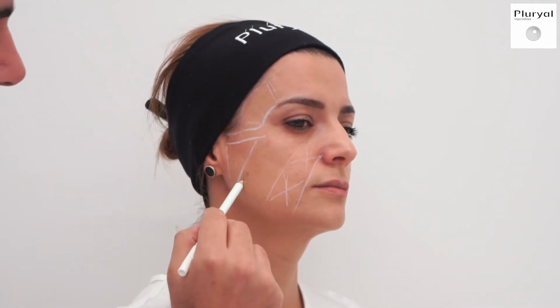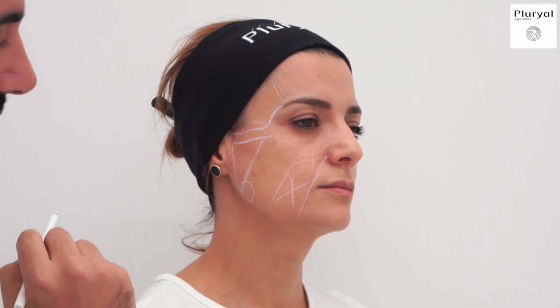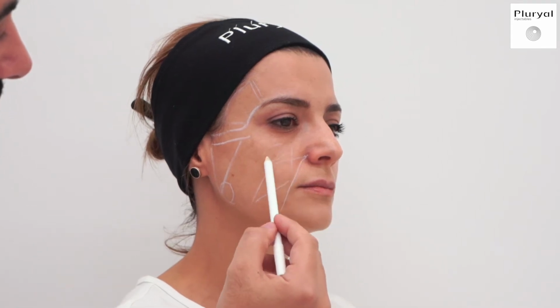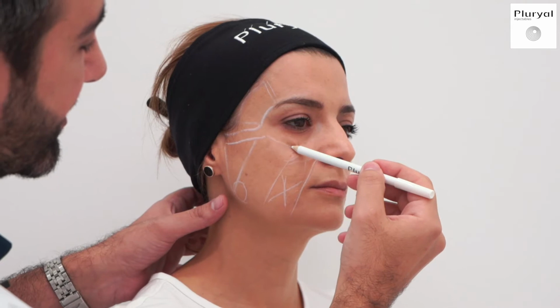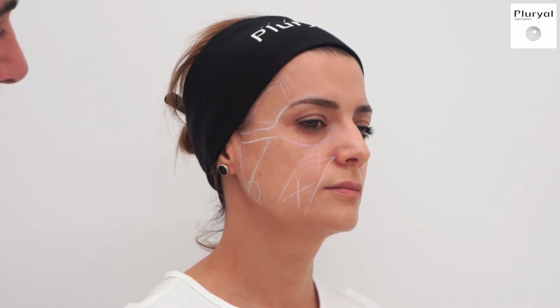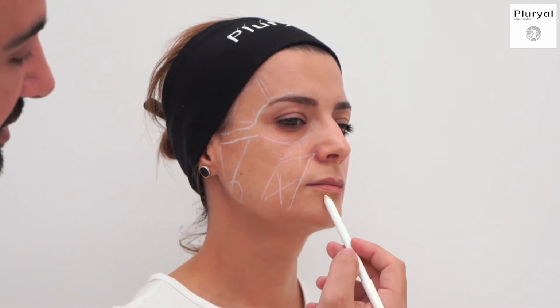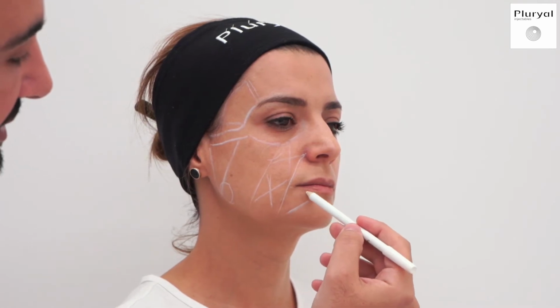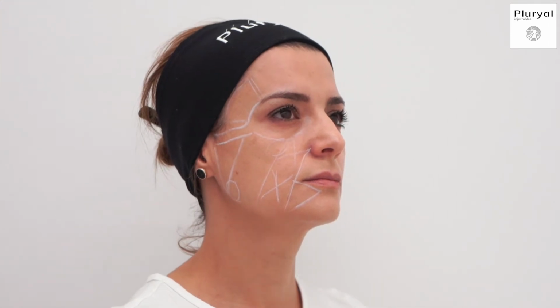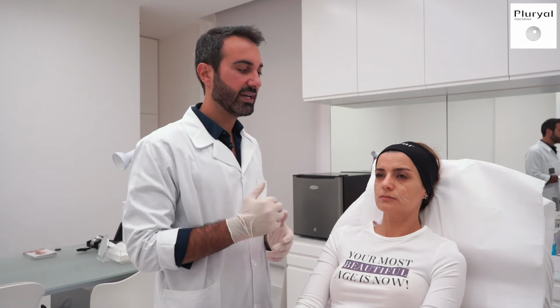Then we will do the gonial angle. Then we will work on the cheek and the tear trough, or the suborbital area. At the end, we will be working also on the Marionette triangle. Her chin has a very nice projection, so we will not be using any fillers in the chin. Like we said before, we always start from the top and then we go down to the bottom, and laterally, and then we go medially.